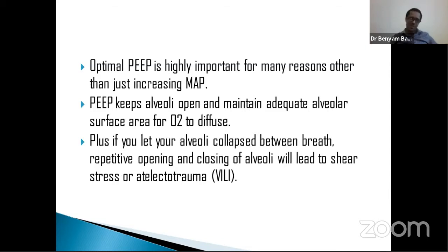Optimal PEEP is highly important. I will come back to PEEP again. I'm not discrediting PEEP. I agree PEEP should be optimally increased because there are consequences if you're not increasing the PEEP. The reason we increase the PEEP, as we mentioned earlier, is that it keeps alveoli open and maintains adequate alveolar surface area for oxygen to diffuse during expiration.